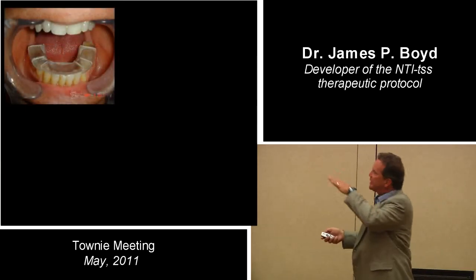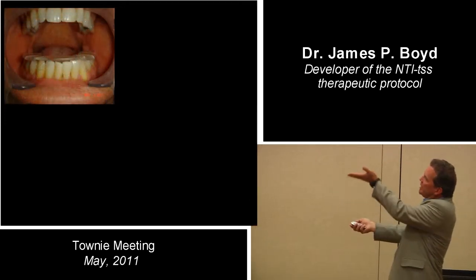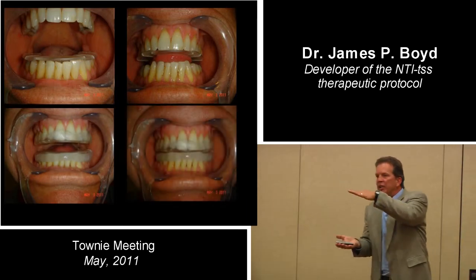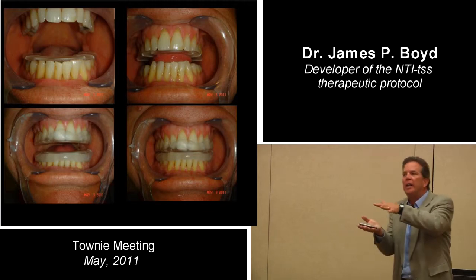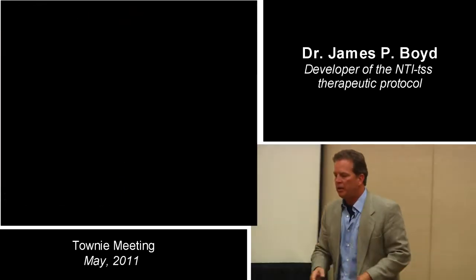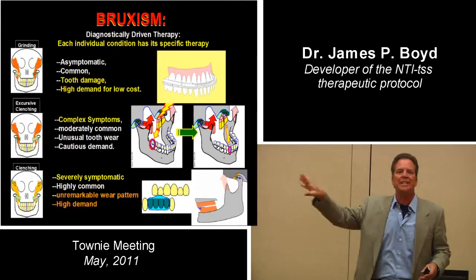So here's the lower flat plane setting on the lower arch, allowing it just to rest flat, an upper plane now resting flat. Both have thermoplastic. And a gentle closing allows both flat planes to rest on each other without contorting. And now the patient is relaxed with these things just touching. And then once it cools, it's comfortable and it's easy to move around on.